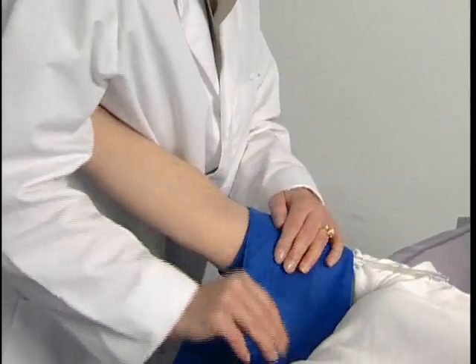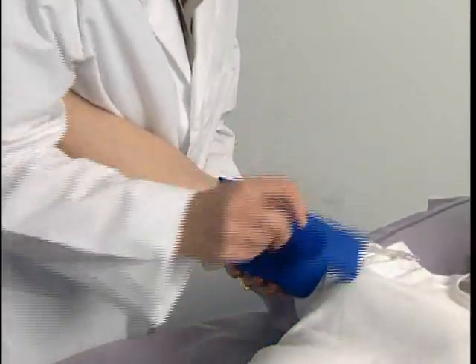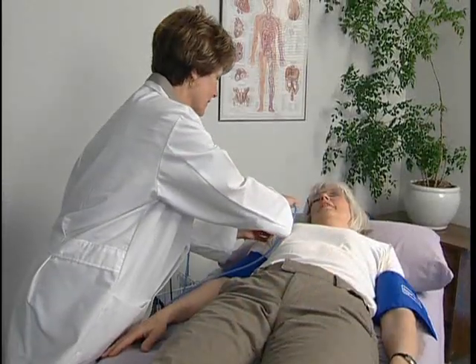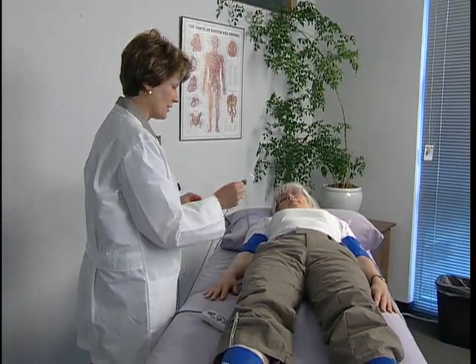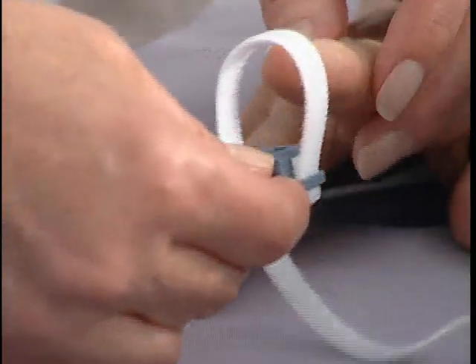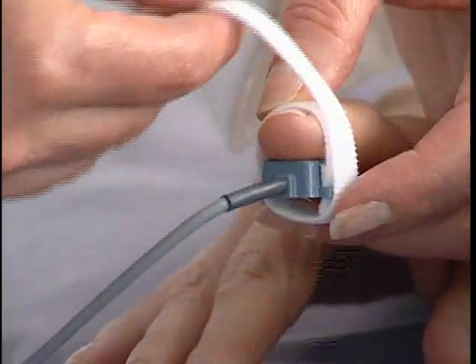Wrap a cuff at each arm to prepare for the exam. Use the appropriate size cuff based on the circumference of the limb. Start at the right brachial artery site and connect the hose to the cuff. The Doppler probe can be used to obtain brachial pressures for a TBI, but in this example, we will use the PPG probe.